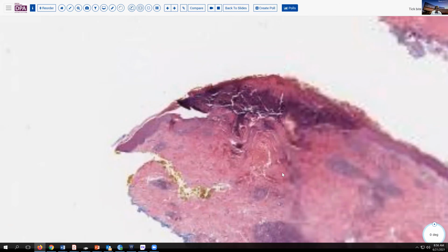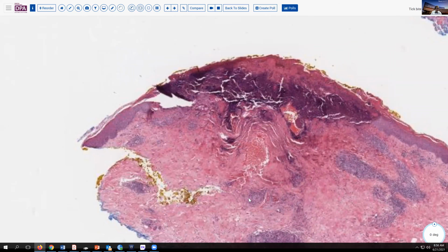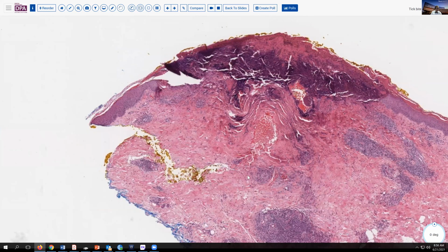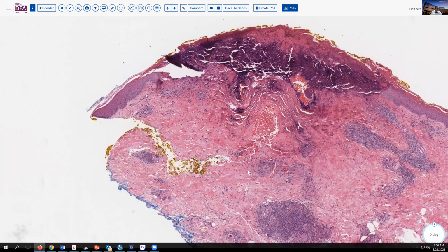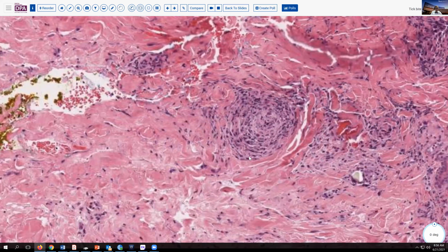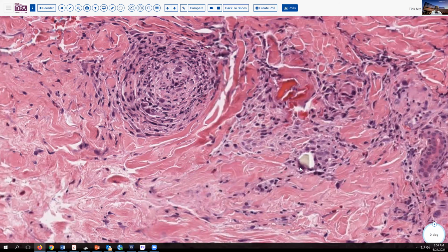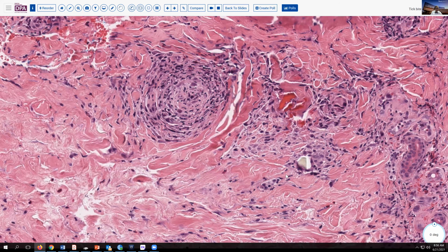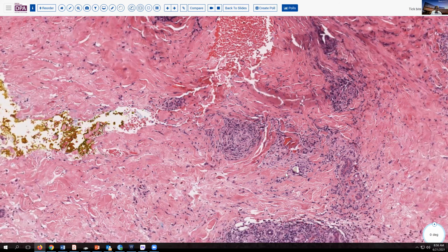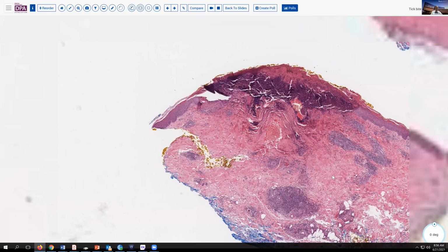And it's certainly not unusual to see a superficial and deep inflammatory reaction in an arthropod insult. What is unusual is to see this degree of cutaneous necrosis, and to, as we have here, actually find little bits of residual foreign material or mouth parts associated with this reaction. So this is a fairly vigorous and dense inflammatory process associated with this arthropod.